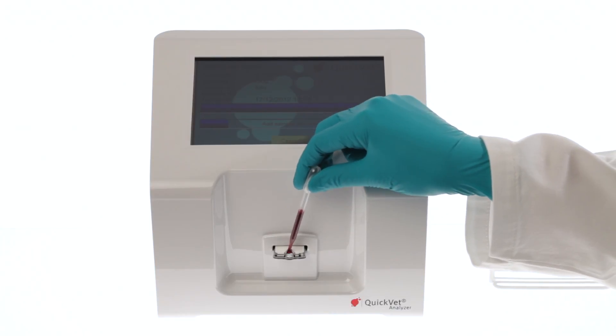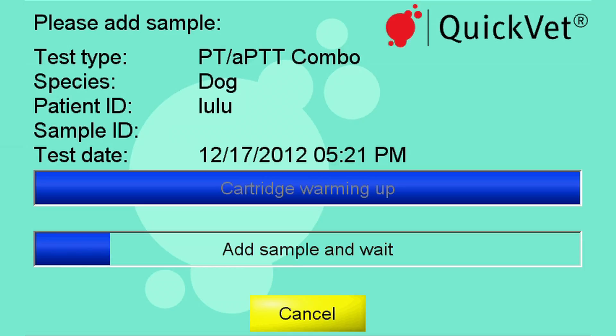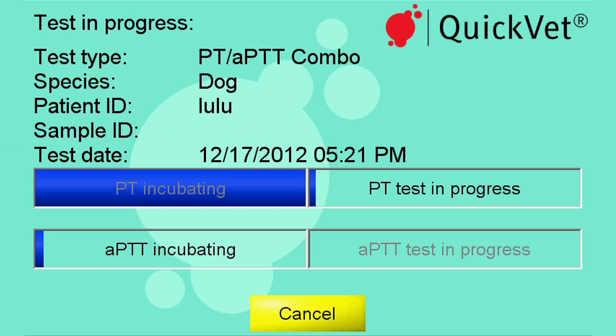It is not possible to overfill the well as in other systems. Once the sample is deposited into the well, the test starts automatically. You may follow the progress on screen.